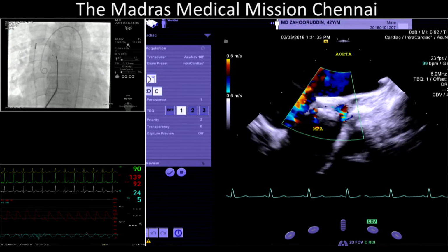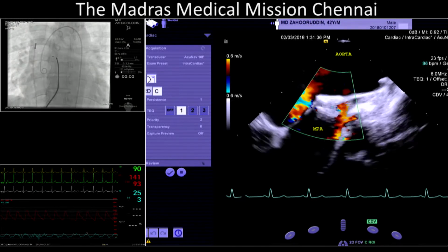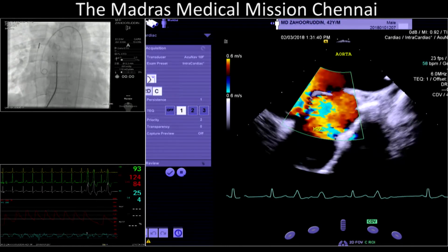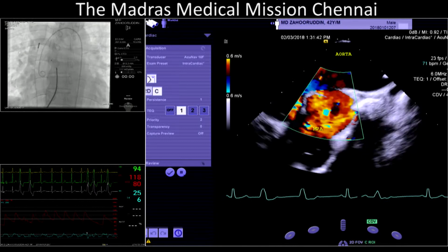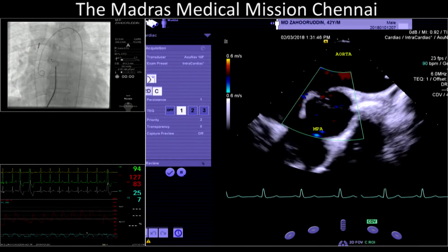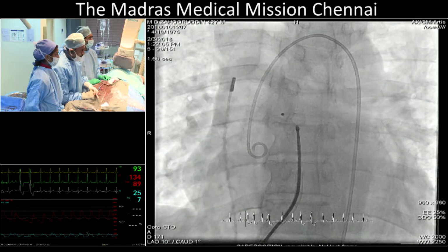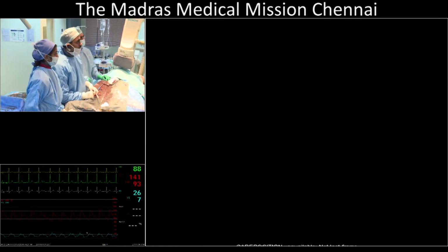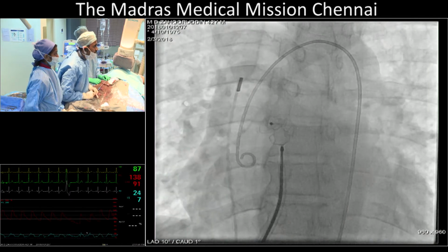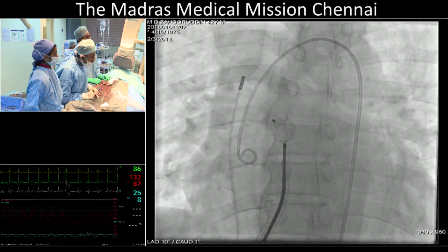So that you have the device as a marker, can you turn the ICE visualization around the probe so that we see the other plane? Can you see that I am actually pulling it? Can you see the fluoroscopy? Fluoro bigger, fluoro bigger. Yeah, now you see. Can you see that I'm actually giving a significant tug?